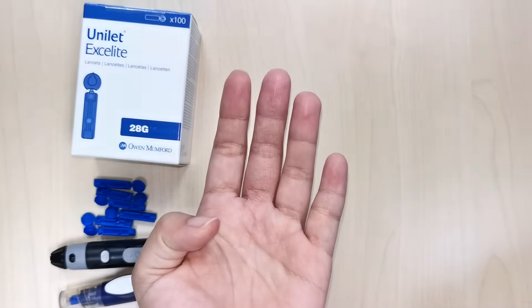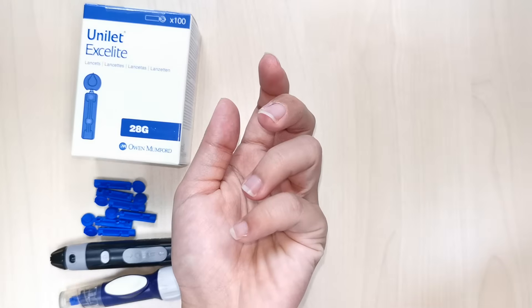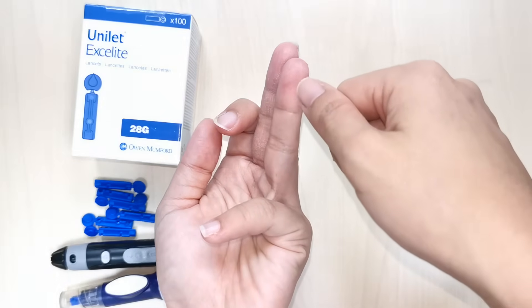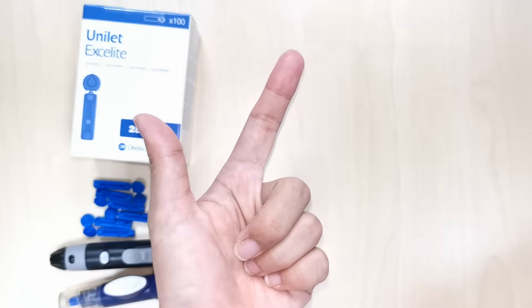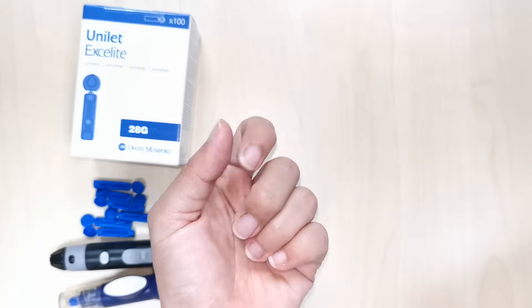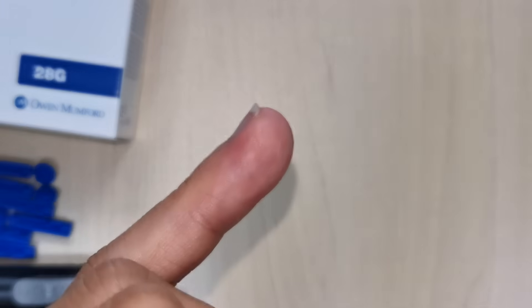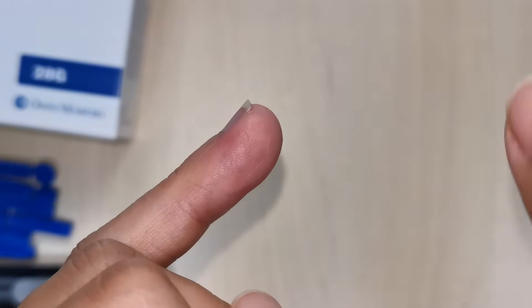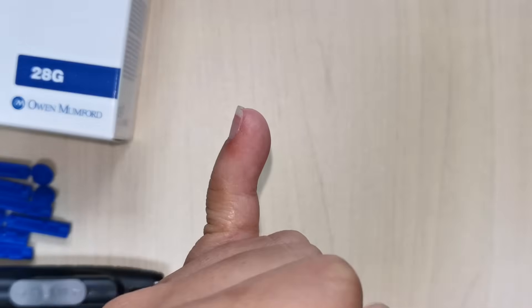Where should you puncture? The finger is the preferred site for adults and children over 6 months weighing more than 10 kilograms. The puncture should be done on the side of the ball of the finger and restricted to the middle and ring fingers. The thumb and index fingers, which can be calloused and sensitive, should be avoided. Puncture across the lines of the fingerprint, not parallel to them, as a parallel puncture may cause blood to travel along the channels, preventing drop formation. Avoid the little finger because the tissue depth is small and there is a higher risk of causing bone injury.